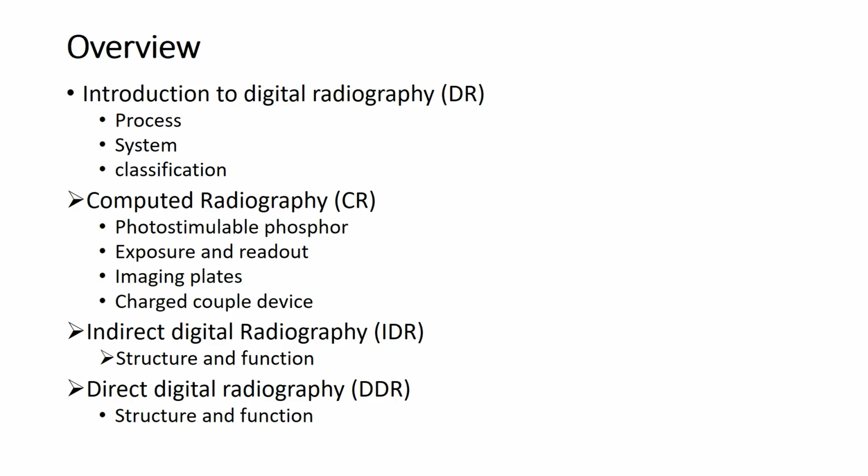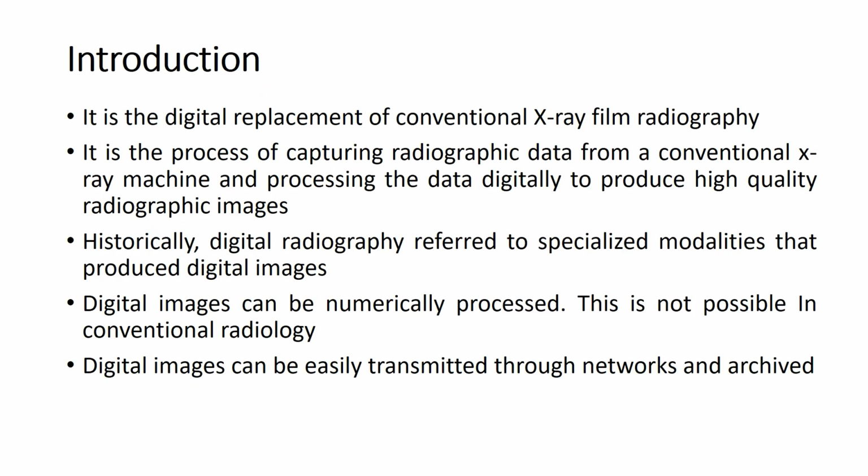And we will also discuss the advantages and disadvantages of digital radiography, and finally we will conclude today's lecture. So, this is a total overview of today's lecture. Let us start with the introduction to digital radiography.